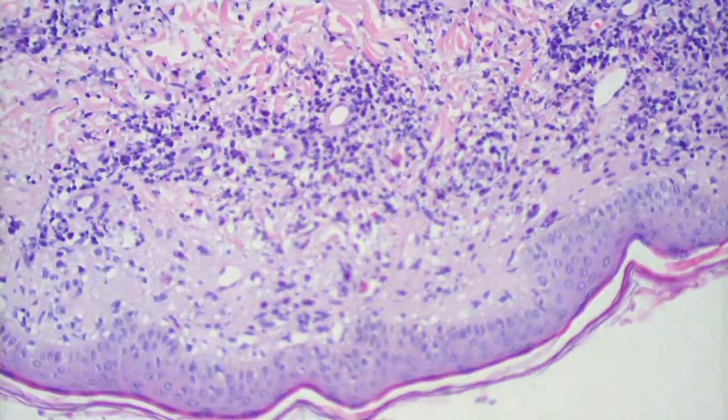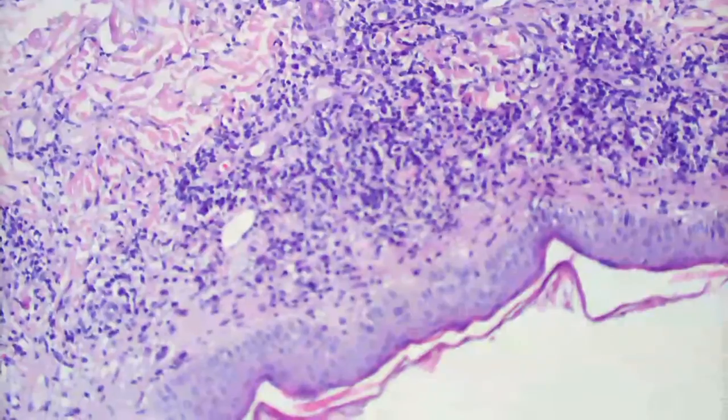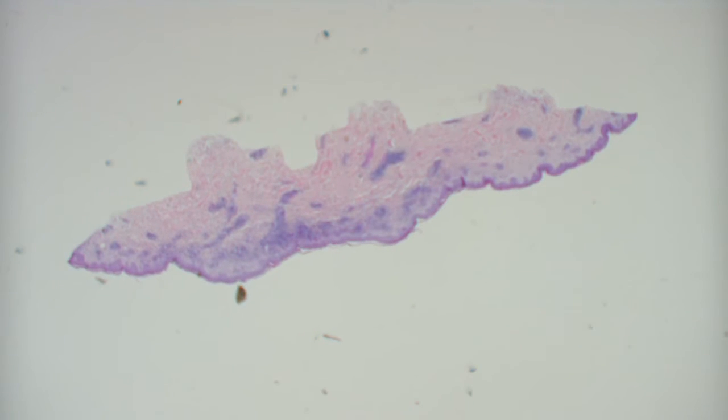So this is syphilis, so that's exactly right. What's the most common histologic pattern of syphilis? You have the elongated, reedy acanthosis. Yeah, superficial and deep psoriasiform lichenoid. That's the classic form of secondary syphilis, but you can see some that are just superficial perivascular. You get some that have a lot of interface change and almost look like pityriasis lichenoides. I've seen some that look almost exactly like lichen planus, and some that look like psoriasis. So syphilis can look like a lot of things under the microscope. It's the great imitator both clinically and histologically.